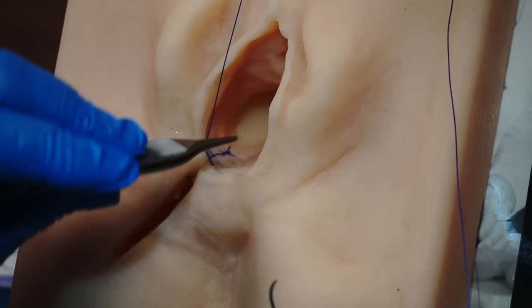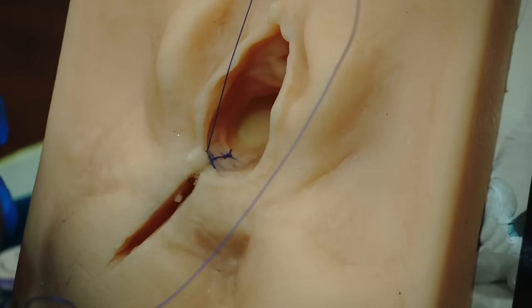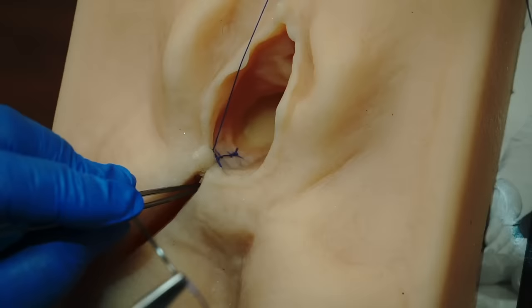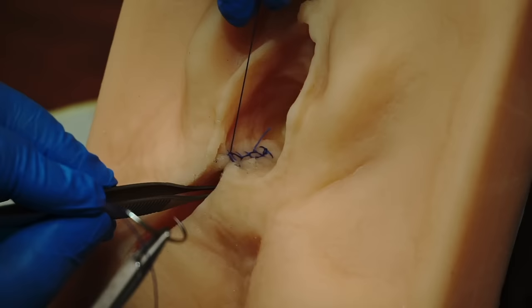So now you can see I have run this continuous locked stitch with 2-0 Vicryl down to the level of the hymenal ring and I'm about to place the crown stitch just underneath the hymen. However, my recommendation and practice in my own perineal repairs is to protect this needle on a hemostat and put it to the side. I would then take a separate needle and place deep interrupted sutures into the deep vaginal submucosa to prevent perineal hematomas. Depending on the perineum, it might take two or three sutures like this to close that dead space.